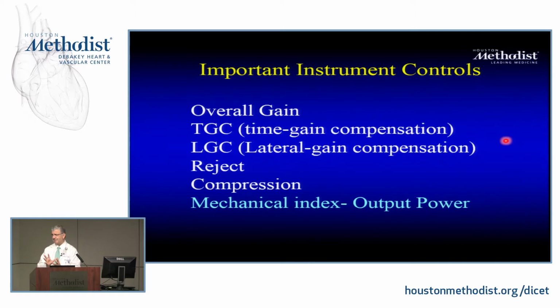All these are post-processing. I already sent this energy down to interact with my structure, and I'm getting this energy back in my transducer, and I'm processing it, okay? All these are not influencing what you sent. What you sent is already built into the machine, but there's one thing that you usually play around with, which is the mechanical index, or the output power. But a few other settings are already occurring in the machine.